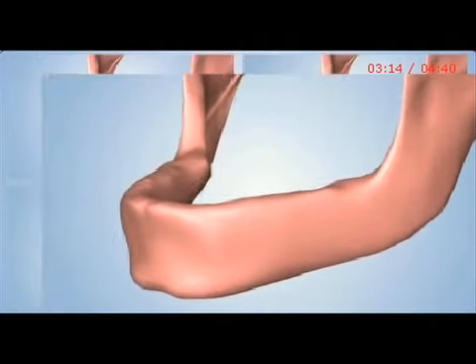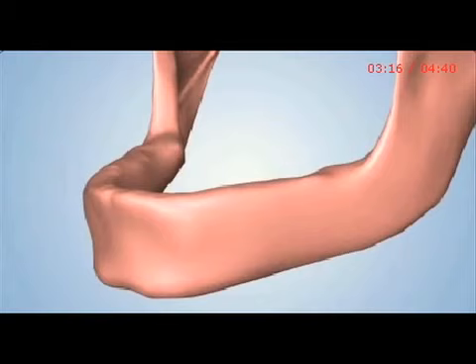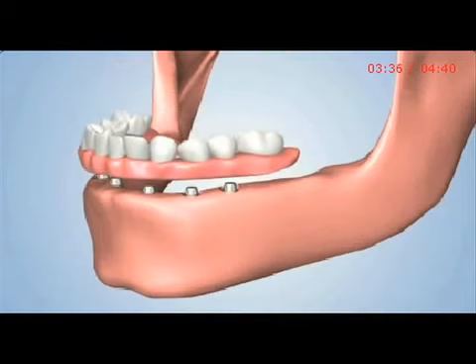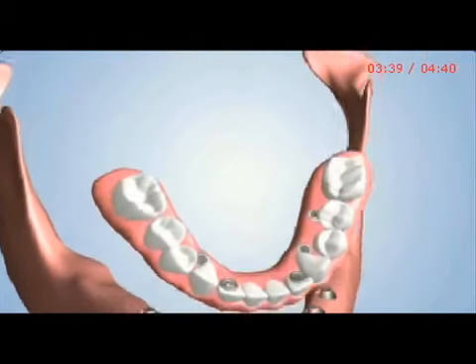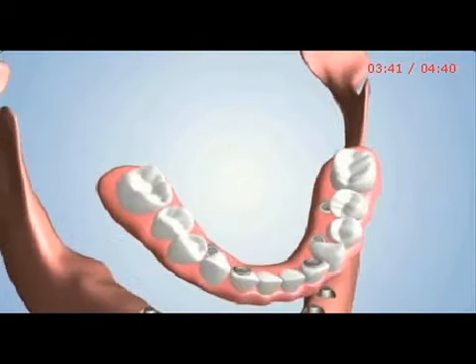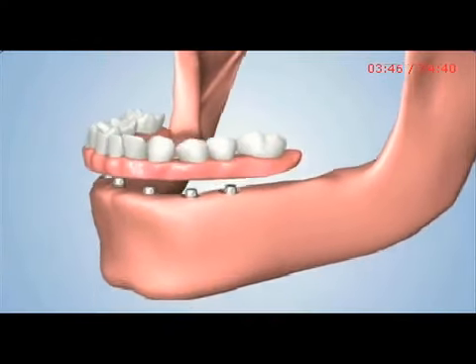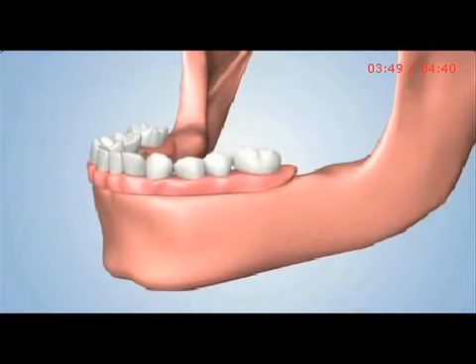A fourth option involves the placement of five or six dental implants. Specialized attachments cover the implants to facilitate the placement of what is known as a fixed detachable denture. The denture is designed with small holes that allow specialized screws to pass through and connect it directly to the implants. This is a very stable and secure treatment option that can only be removed or detached by a dental professional.